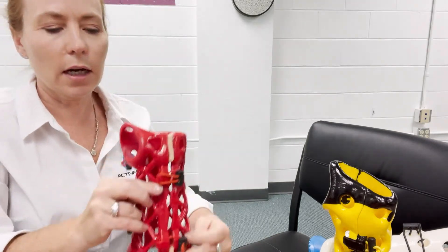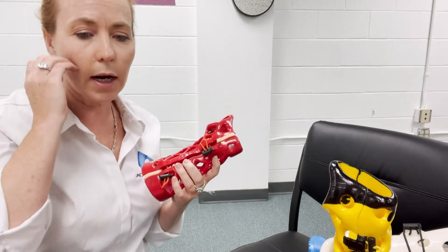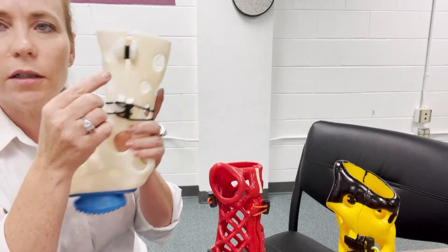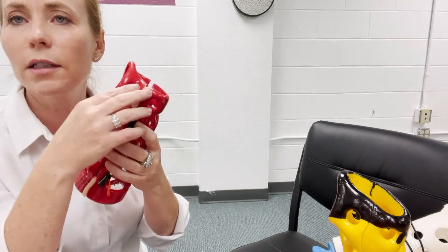So that's how you accommodate by adding space. With the locked-on cast, you're going to use the little Lego spacers. With the removable cast, you use the Plastizote down the seam, and then you can take that in and out.